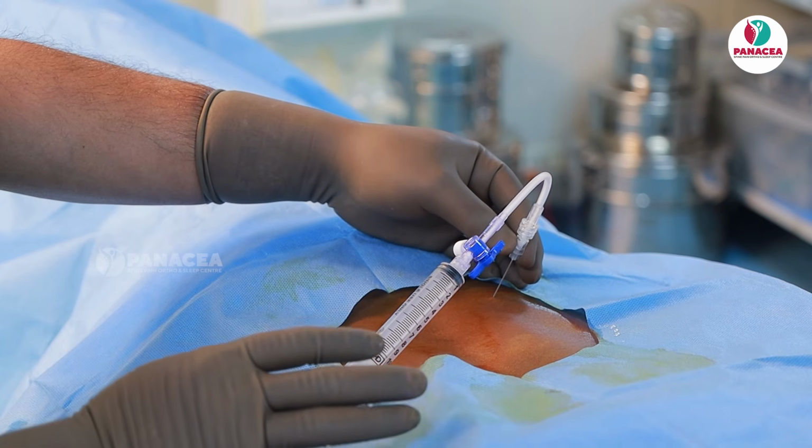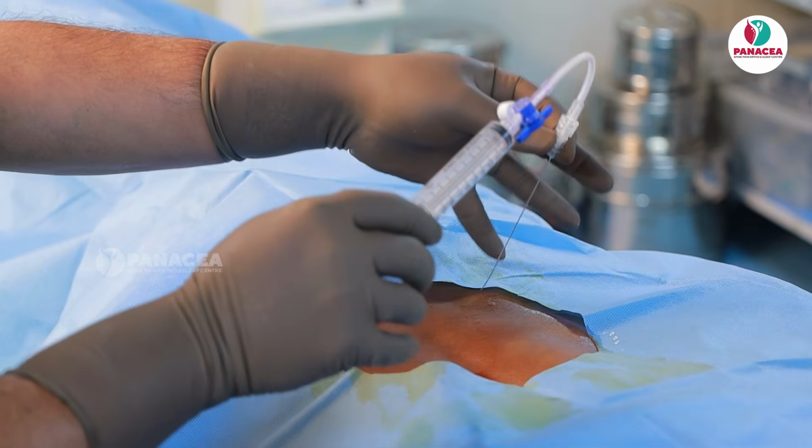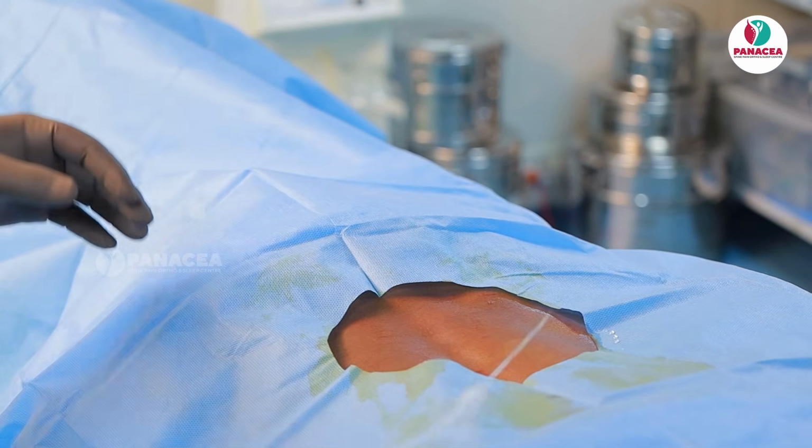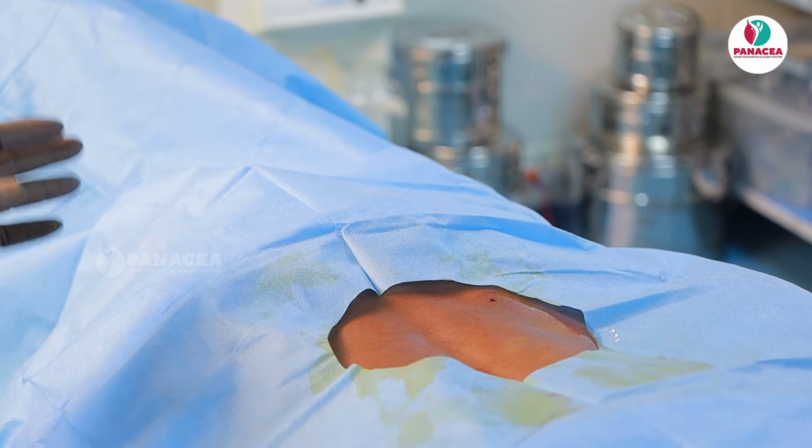The procedure is coming to an end. Once it is done, we are going to keep the patient for the next 2 hours for observation. It's a daycare procedure. We can send the patient home after 2 hours.